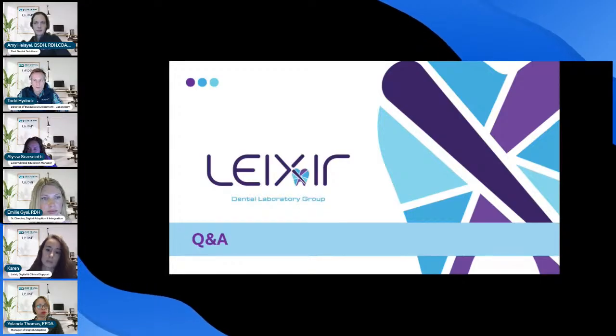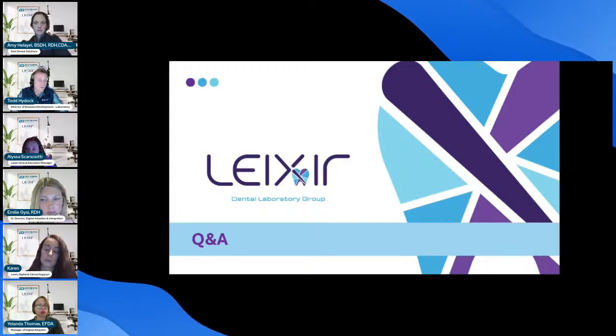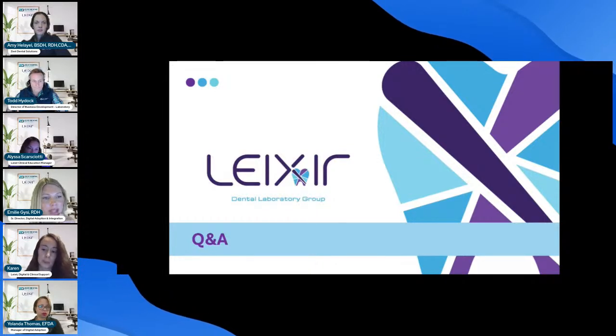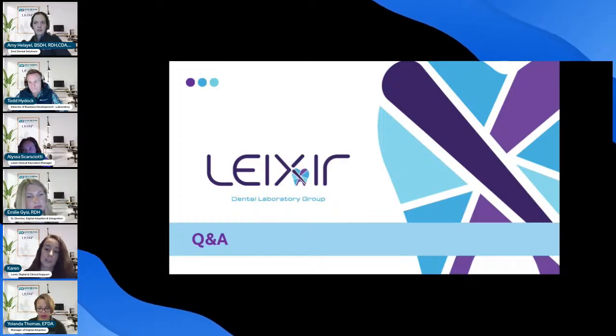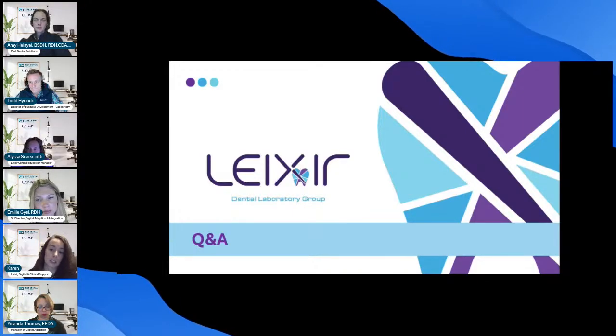But I definitely would recommend talking with the lab about the various metal reinforcement options, or there are even alternative materials out there that we can reinforce these dentures with now. Yep, we do. We have many different options for reinforcement. We can put another wire reinforcement, mesh, and then we do have other material alternatives that we can use if you have a patient that's constantly breaking these.